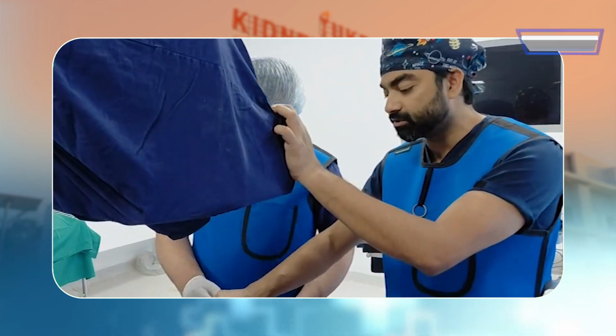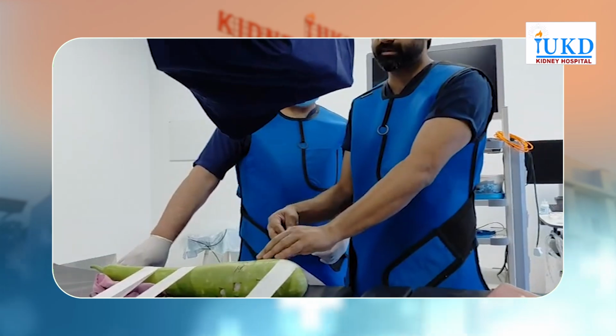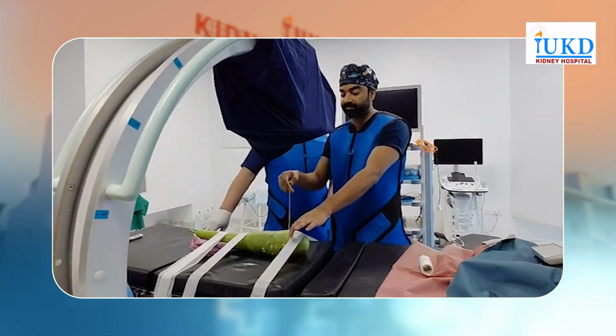Is there. Okay, you mark this at 0. Show me 0. Mark 0 also. Okay, so this is where it is anatomically located. Okay, so this is the point.